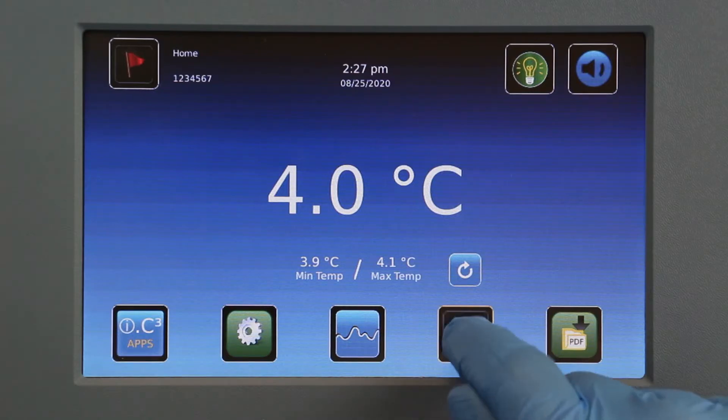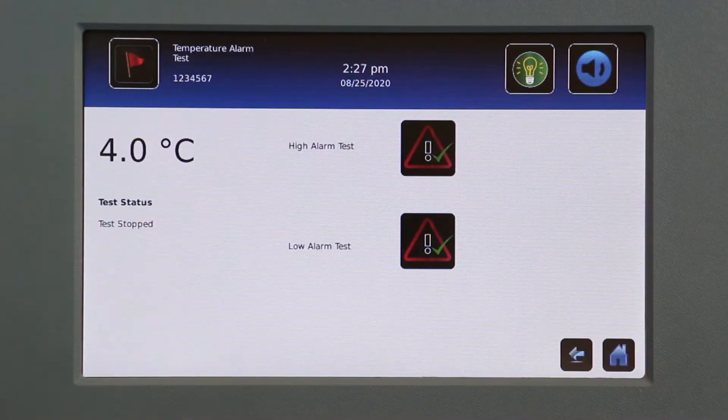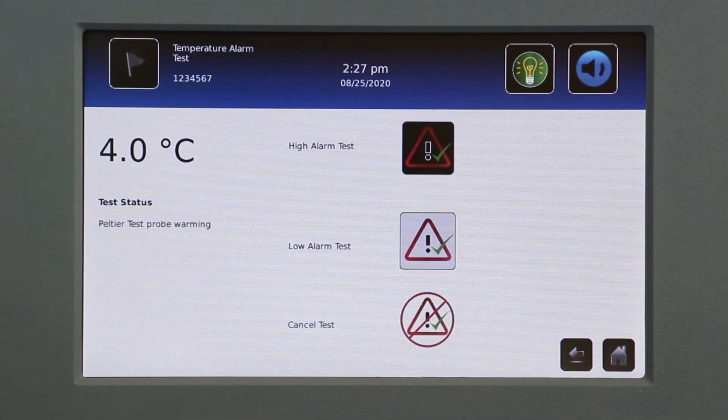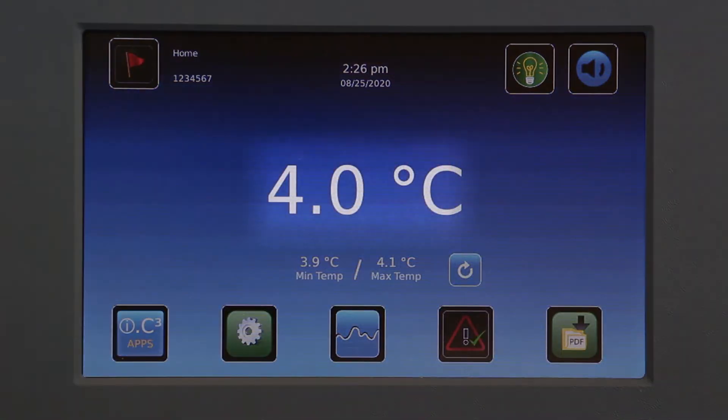With the I-Series Automatic Alarm Test, the tip of the probe is physically heated or cooled, testing the alarm system without affecting the temperature of the stored contents.